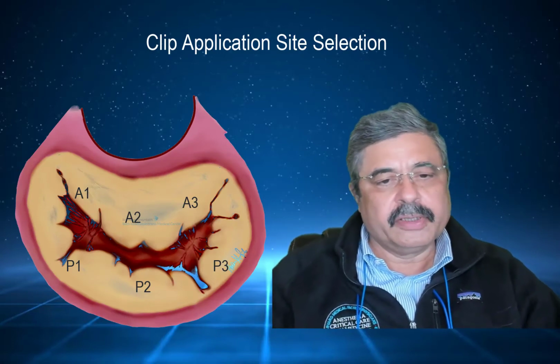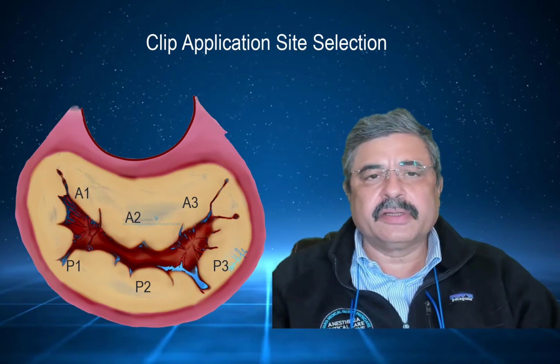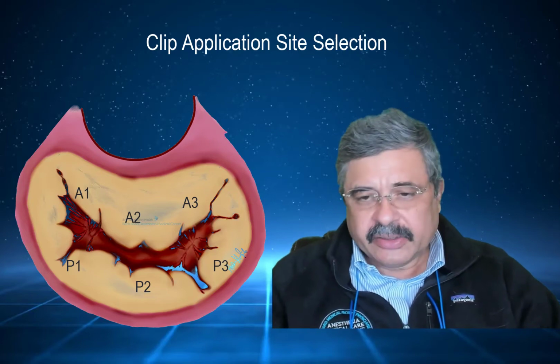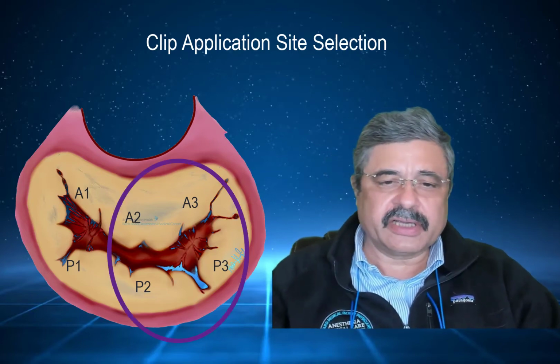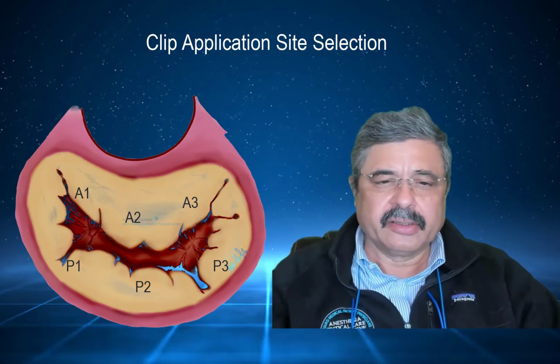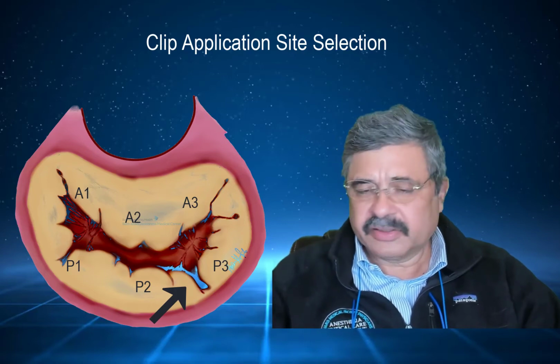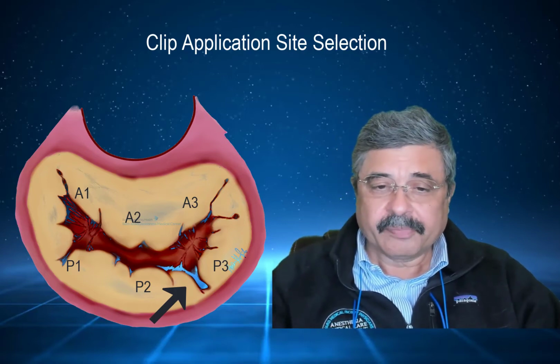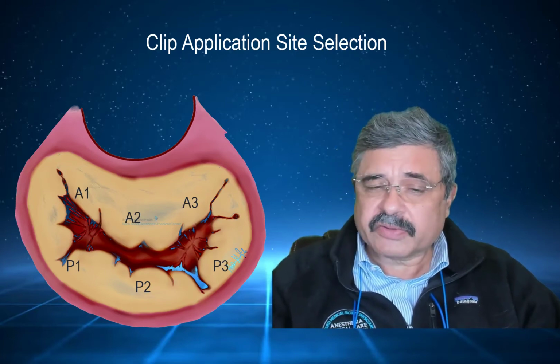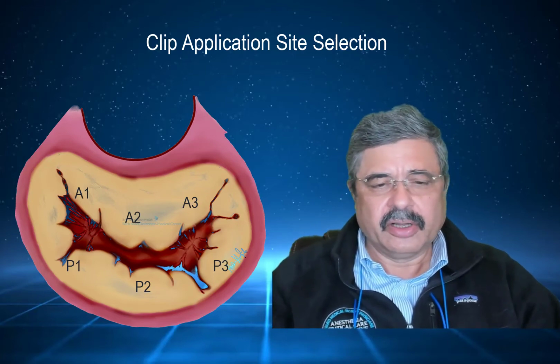Based on this monoplane 2D examination of the mitral valve, it can safely be assumed that the site of regurgitation in this specific patient is A2P2 and A3P3 scallops of the mitral valve, with a major MR jet originating from retraction of the A3P3 scallops of the mitral valve. Whereas three-dimensional echocardiography was helpful, the monoplane two-dimensional examination of the mitral valve with color flow Doppler was actually more helpful in specifically localizing the site of the origination of the MR jet.